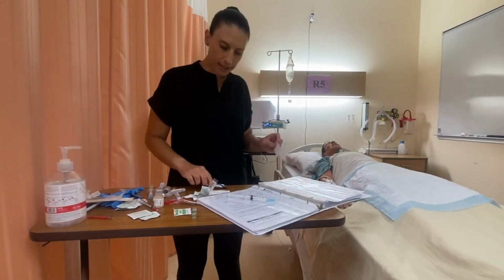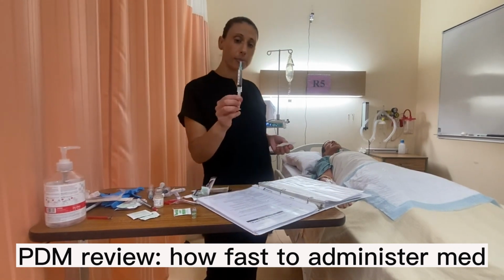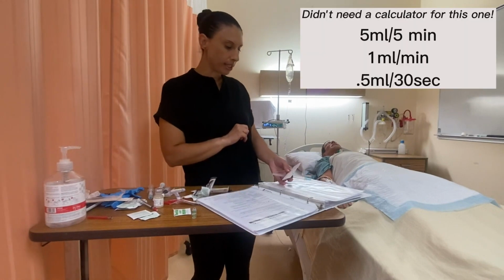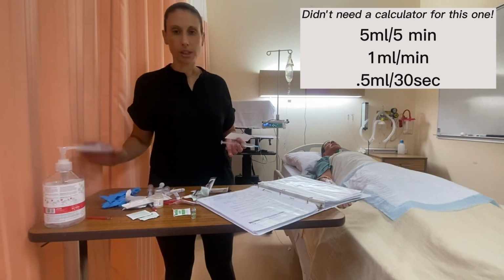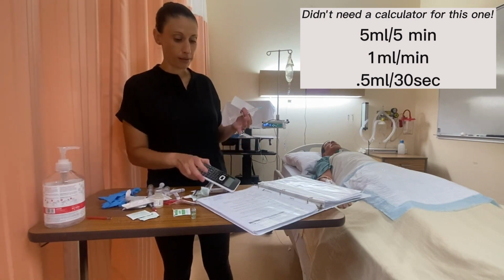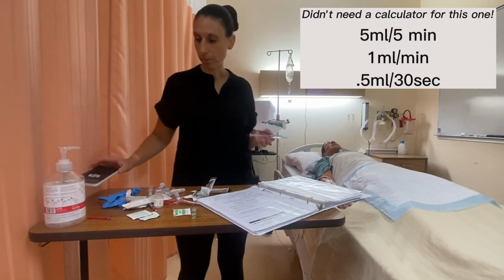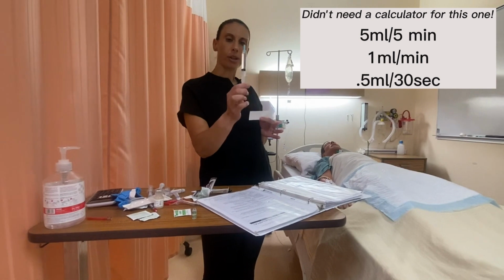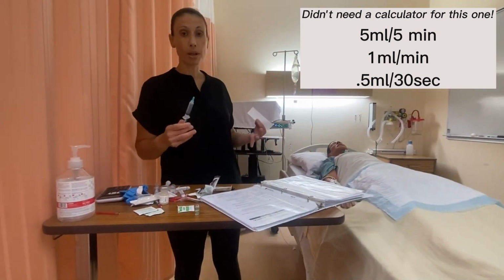And then lastly, the other thing we want to check is how fast to give this medication. So it says over 4 to 5 minutes in our PDM. So here you'll have to do a bit of a calculation, and there are lots of options of what you can program this at, or what you can calculate it at. So you'll need a calculator probably for sure. So what I chose, because I have 5 mLs to be infused over 4 or 5 minutes. So it's up to you what you pick.